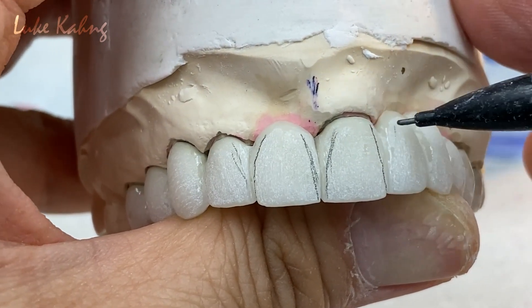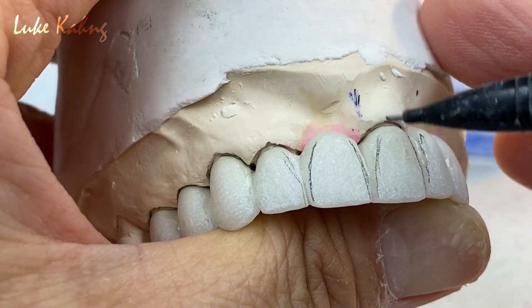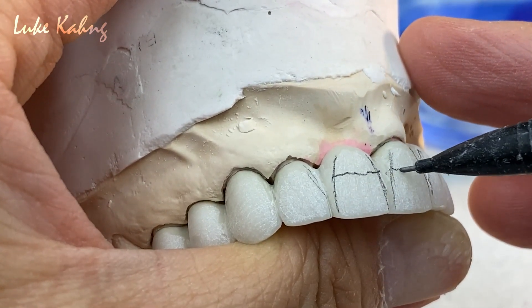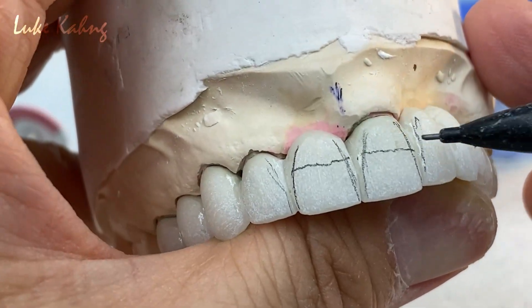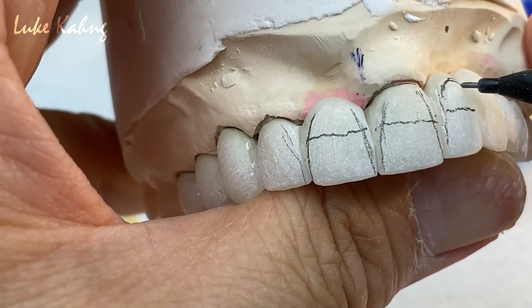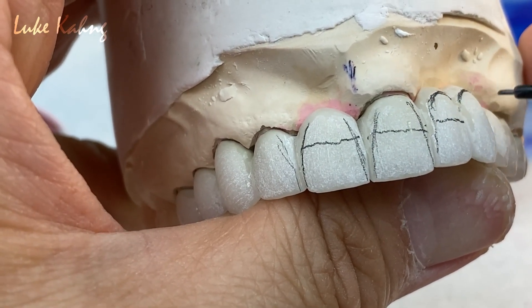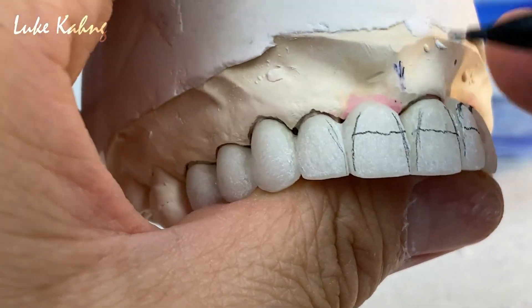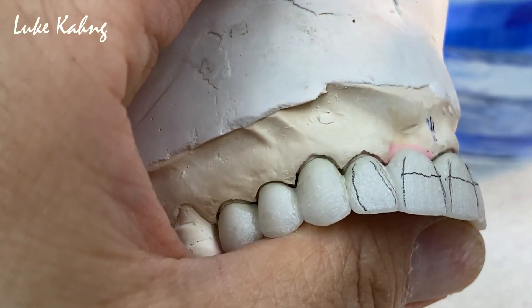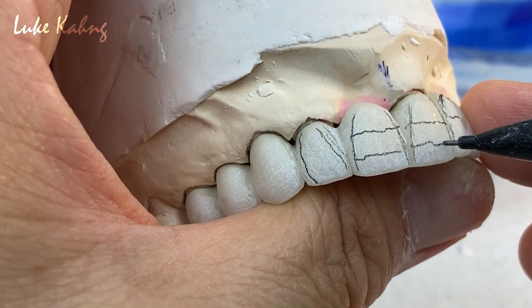Pick it up, match the 8 and 9 on the height of contour. Then it goes through the canine — possibly can use the pink. Here is wider than the other side, so we're trying to bring it in, matching it in the body position.